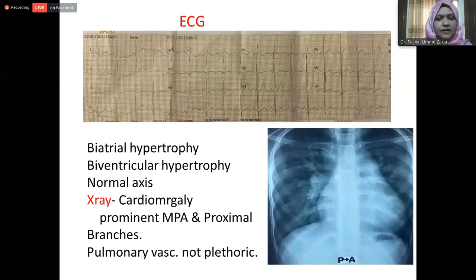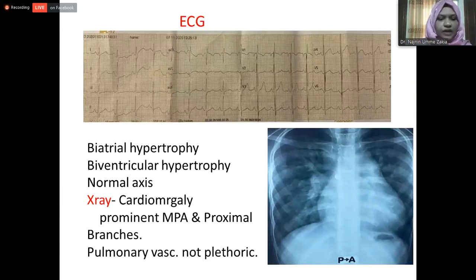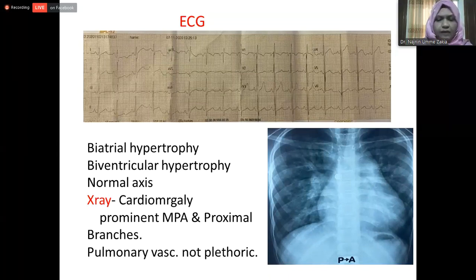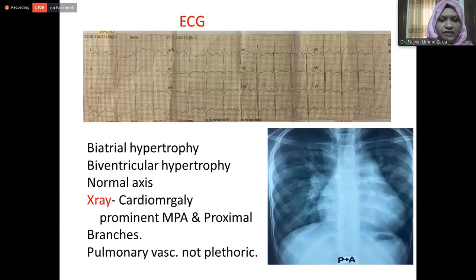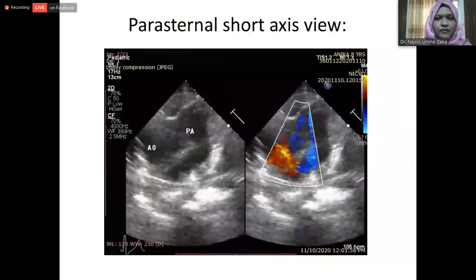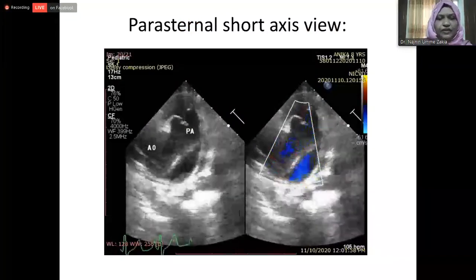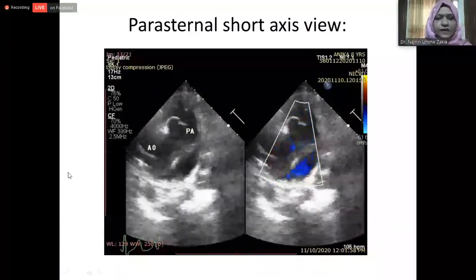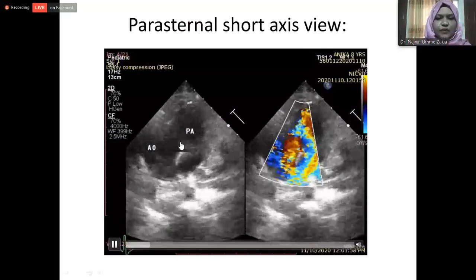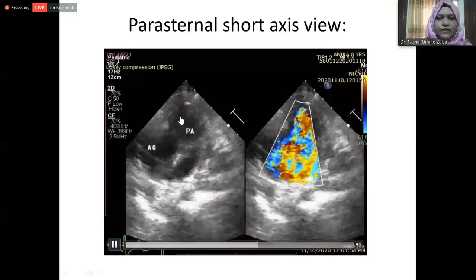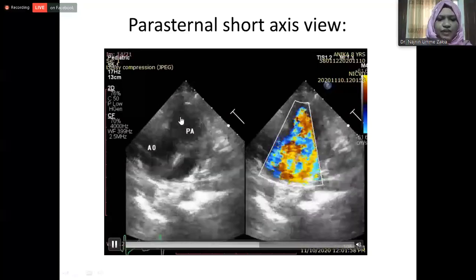Her ECG showed features of biatrial hypertrophy and biventricular hypertrophy. Chest X-ray showed cardiomegaly and prominent main pulmonary artery and proximal branches, and pulmonary vascularity appeared normal. On echocardiography — this parasternal short axis view — we can see there is a large defect in the aortopulmonary septum.